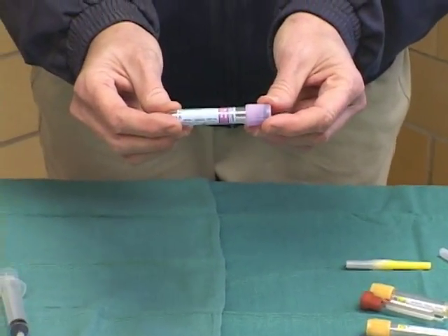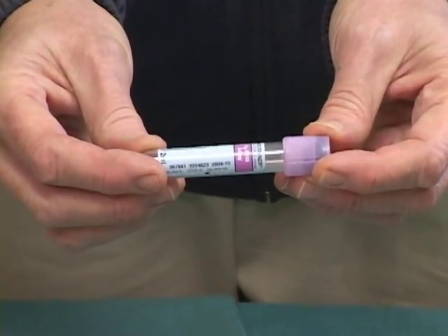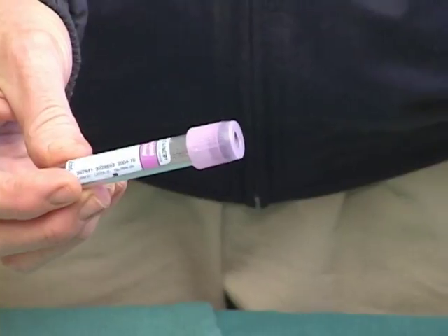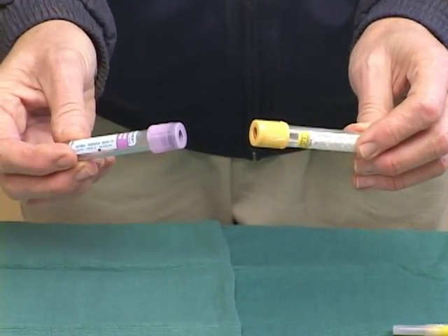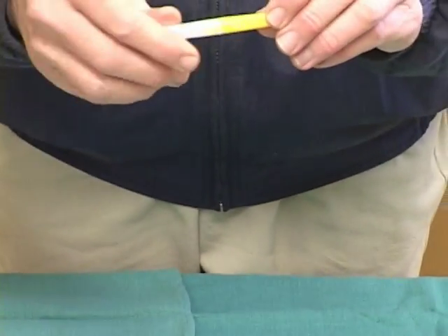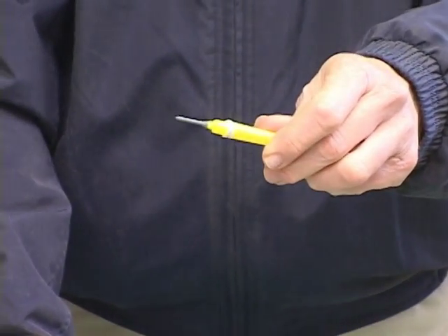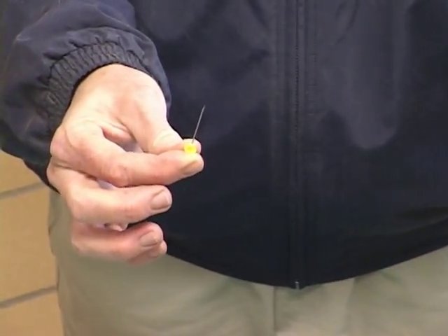Vacutainers are just what the name implies — they're tubes that have a vacuum inside them, so they will actually draw the blood themselves. You'll see there are different colored top tubes, and what this relates to is the kind of anticoagulant inside the tube. The needle you use with the vacutainer system is a double-ended needle: this end goes down into the tube, and this end goes into the blood vessel.